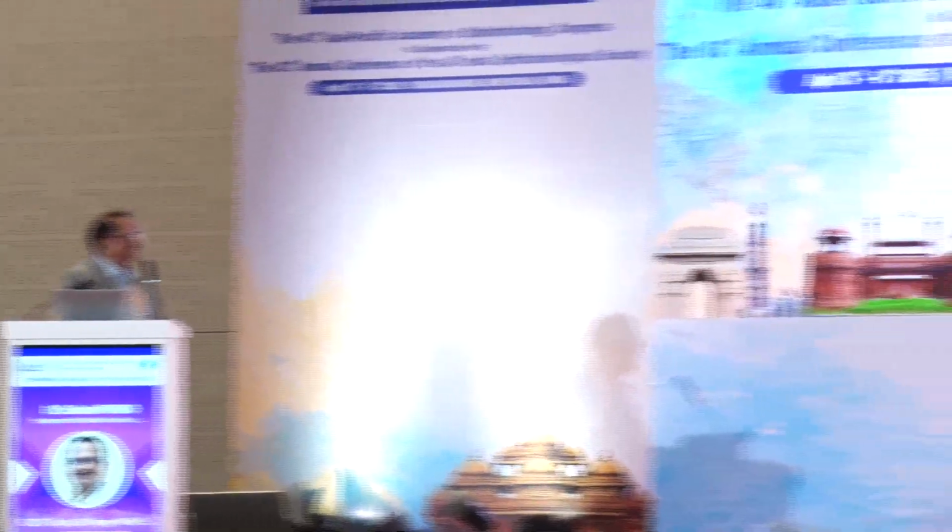Wonderful lecture, sir. I would like to ask, many times when we get the lenses for some toric lenses, for example, 21.5 diopters, it shows the residual refractive error would be plus 0.25. In some, if we get 20.5, we get minus 0.25 or 0.75 of refractive error, because we don't get lenses in odd numbers. So what would be your choice for toric lenses in residual refractive error of plus diopters or in myopic diopters?